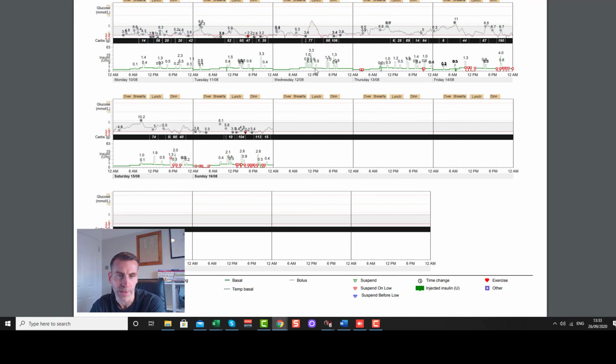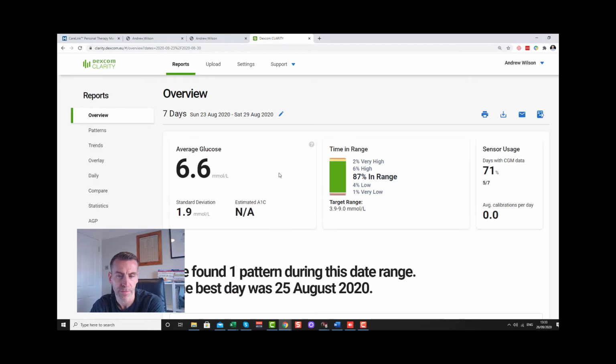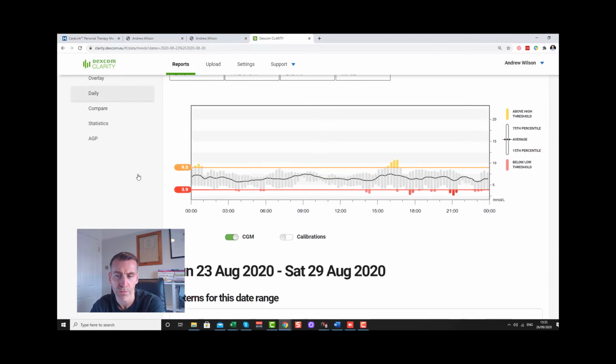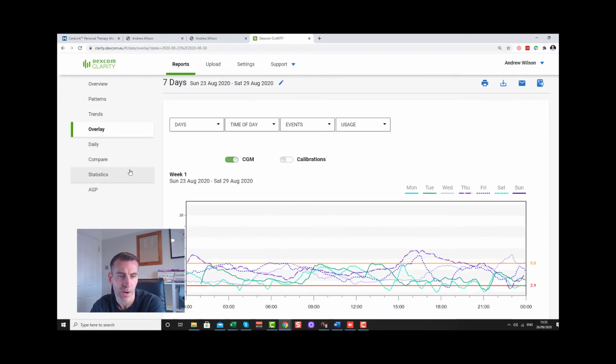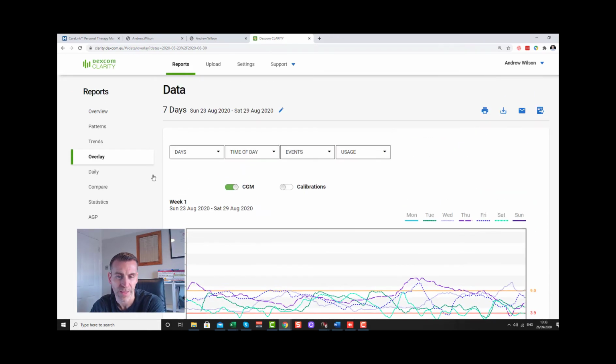It gets awfully complicated. Whereas the Dexcom Clarity is here. If we look at the overview, and I've taken just 7 days again, and we can see it's a bit more visual, a bit more user friendly, I would say. Average glucose, time in range, that's obviously a very important statistic. It's pretty user friendly, this stuff, and I quite like the fact that they make it just very easy to look at. So I quite like the Dexcom Clarity. If I were to compare the two, I prefer the Clarity information.